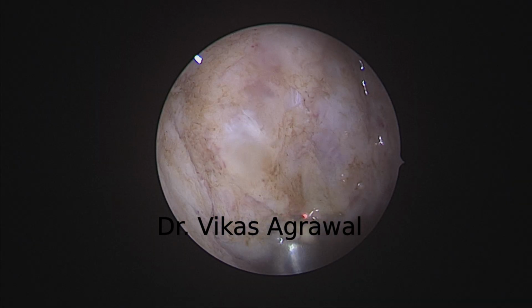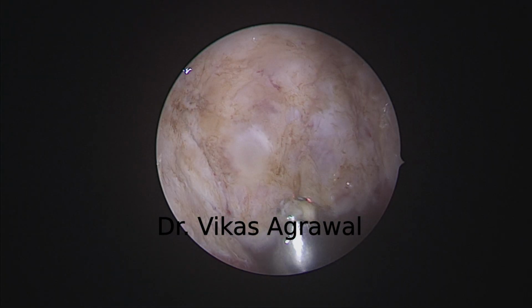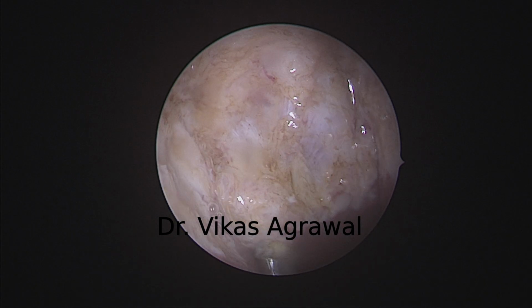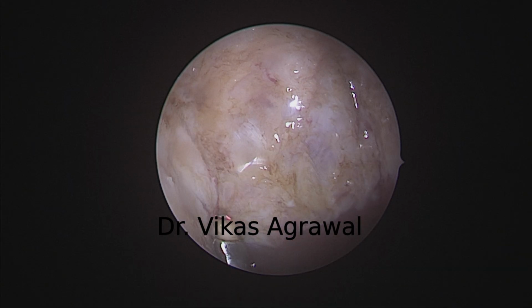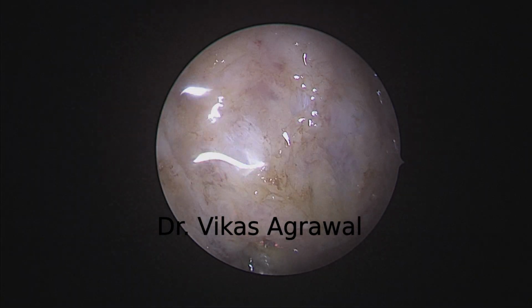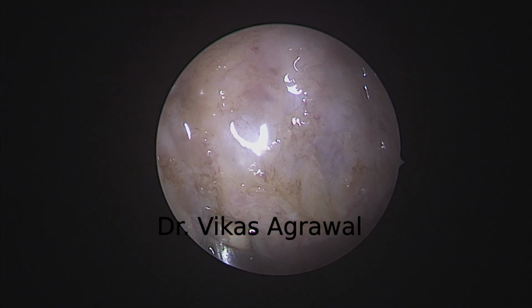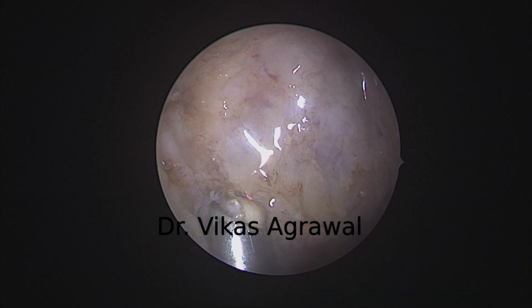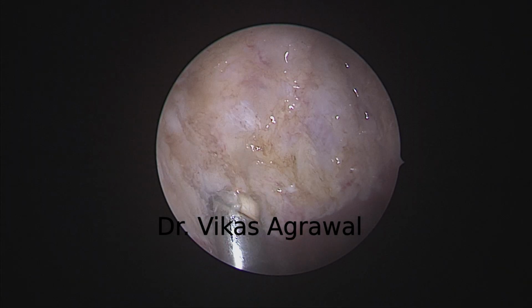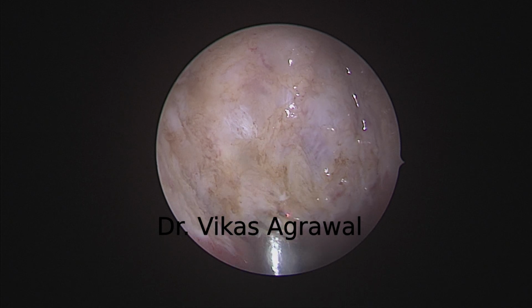That's the Passavant ridge. Because I have already performed tonsillectomy and adenoidectomy with this wand, so naturally the wand is bound to be exhausted. So deep laterally, never go blind because then you can have some bleeder which can trouble.